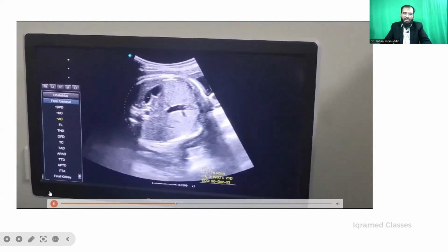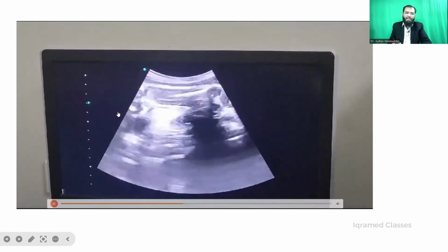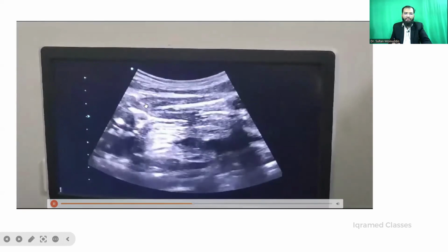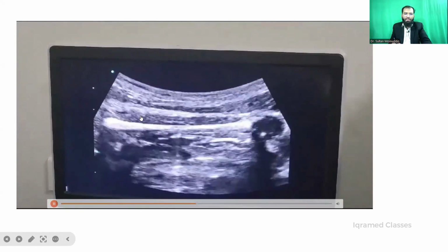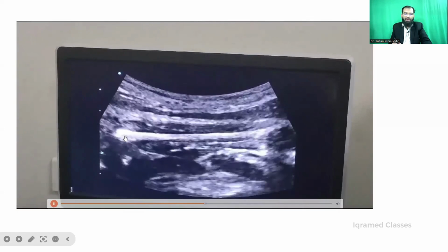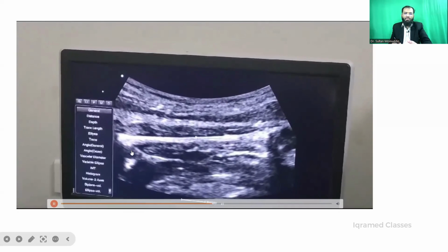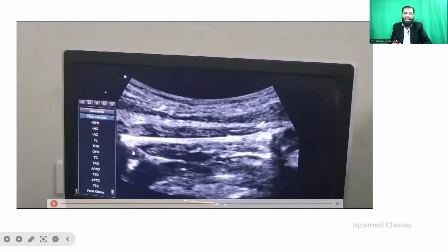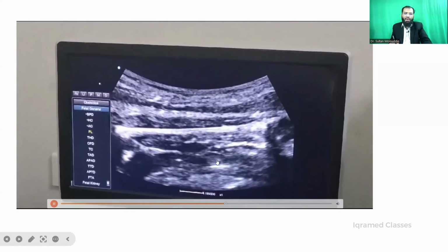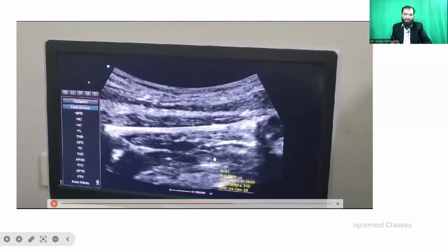After you finish with this, you move towards the bladder. This is the urinary bladder you are seeing here. This is the femur, and we have focused here on the femur. See how we have filled the screen with the thing which we have to measure. We have decreased the gain. The length we measure when measuring the femoral length is the diaphyseal length. This spur is excluded from measurement. The metaphyseal spur is not included when you measure for FL.